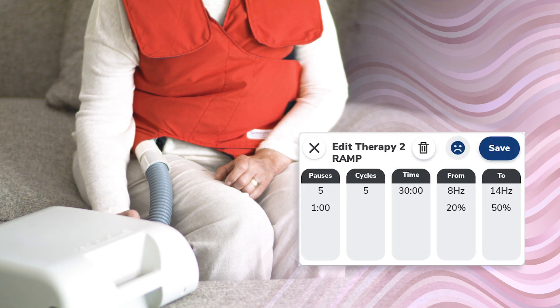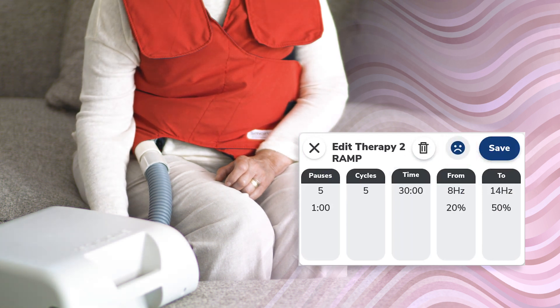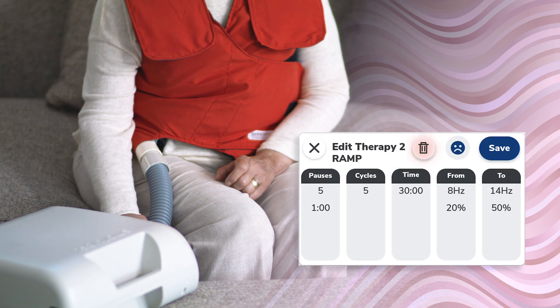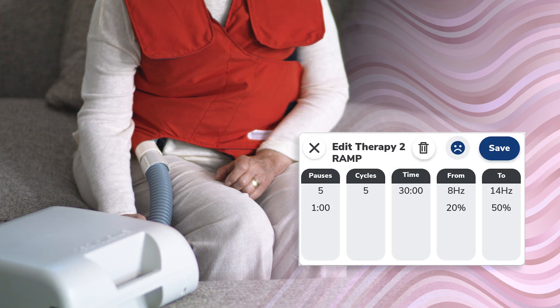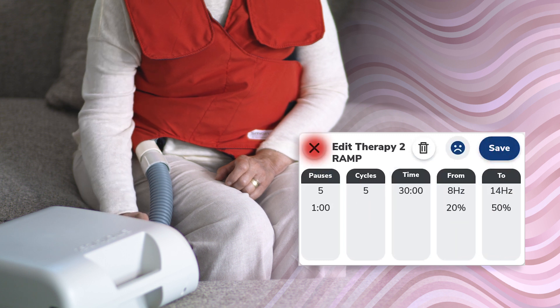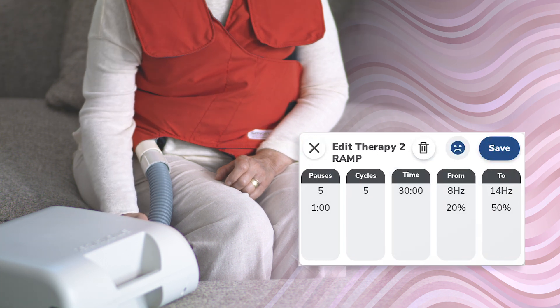To delete an entire programmed therapy, tap on the top middle trash can. Only the highest number therapy is able to be deleted. Tap on the save button to save the edits, or tap on the X to exit without saving edits.